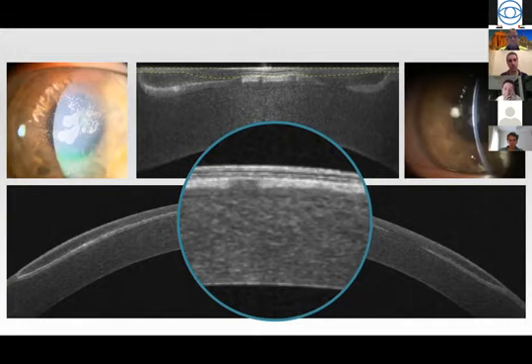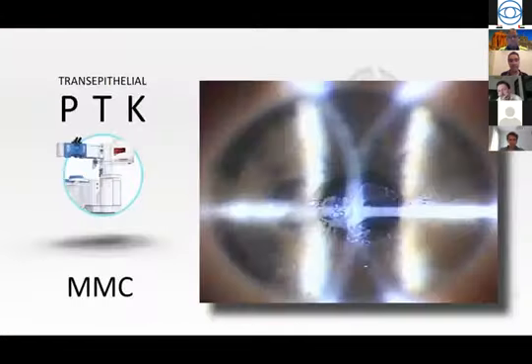PTK. So I decided to go ahead with PTK, put mitomycin. Hopefully mitomycin would kill those epi ingrowth at the periphery a little bit, they would be now shallower than where I did my PTK. And that's what I did actually.